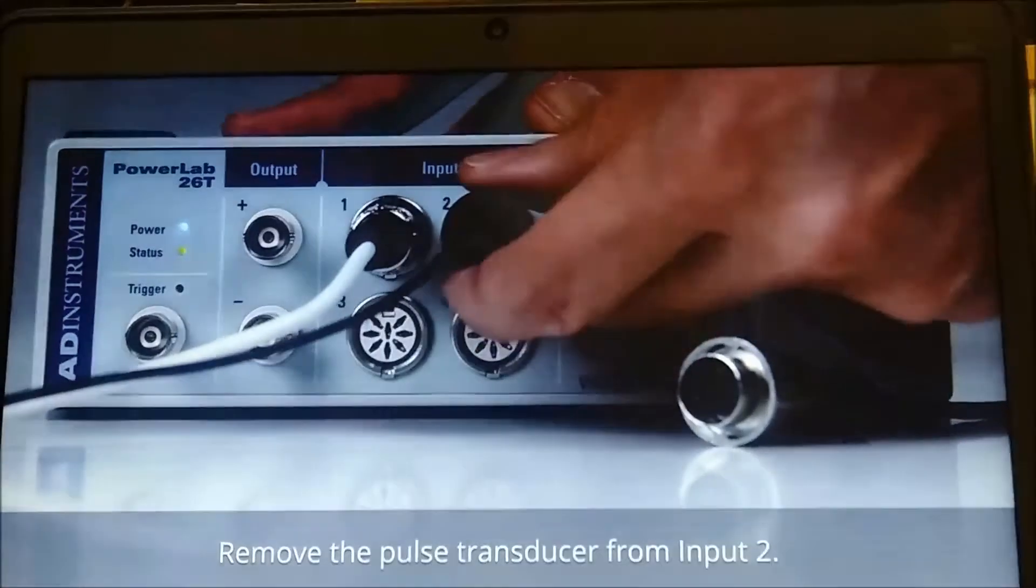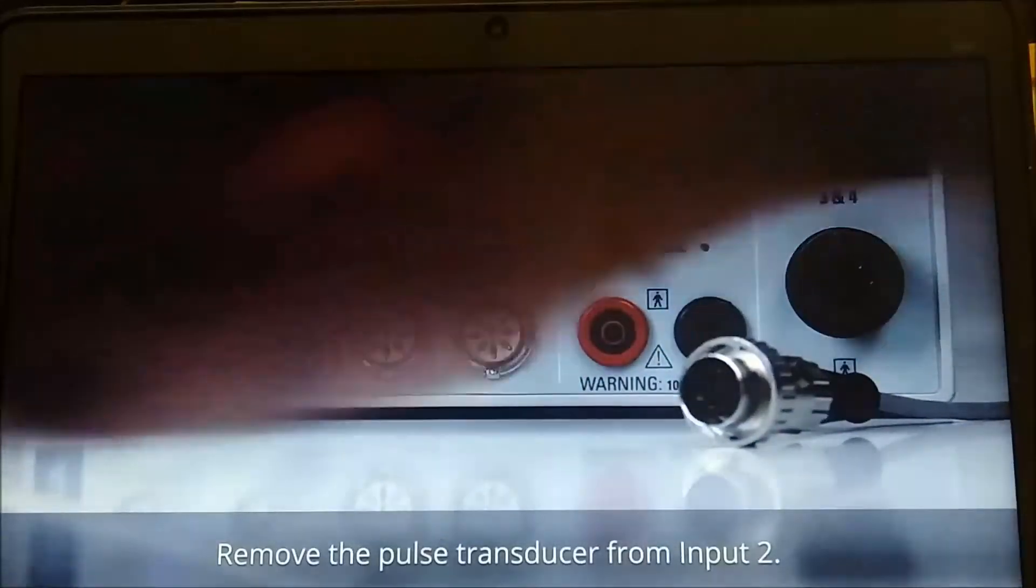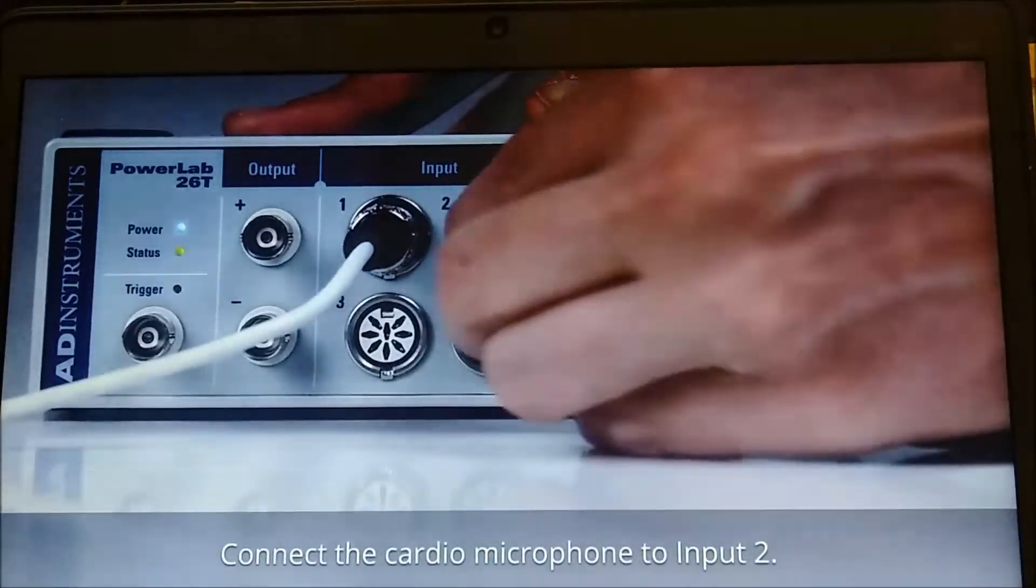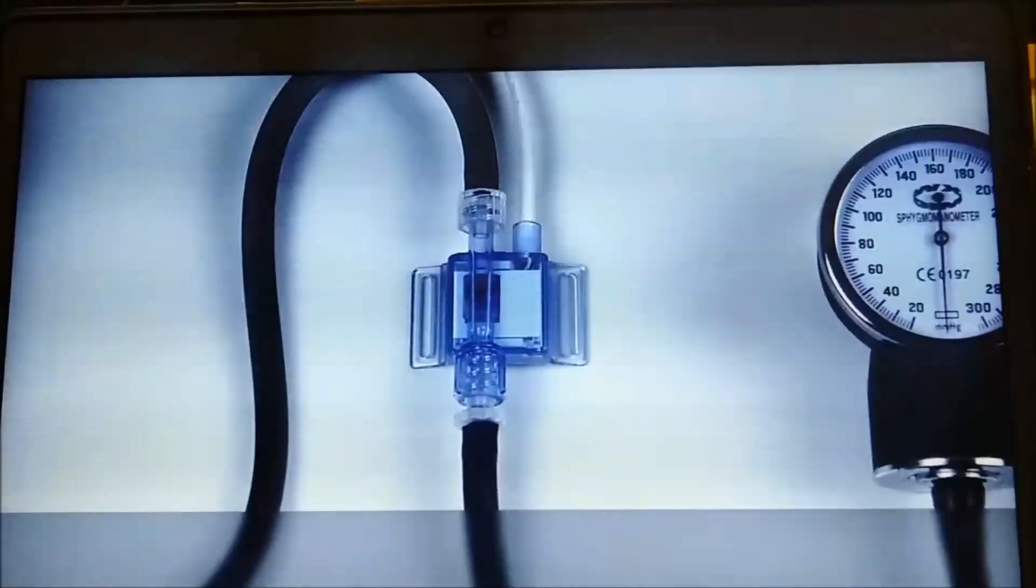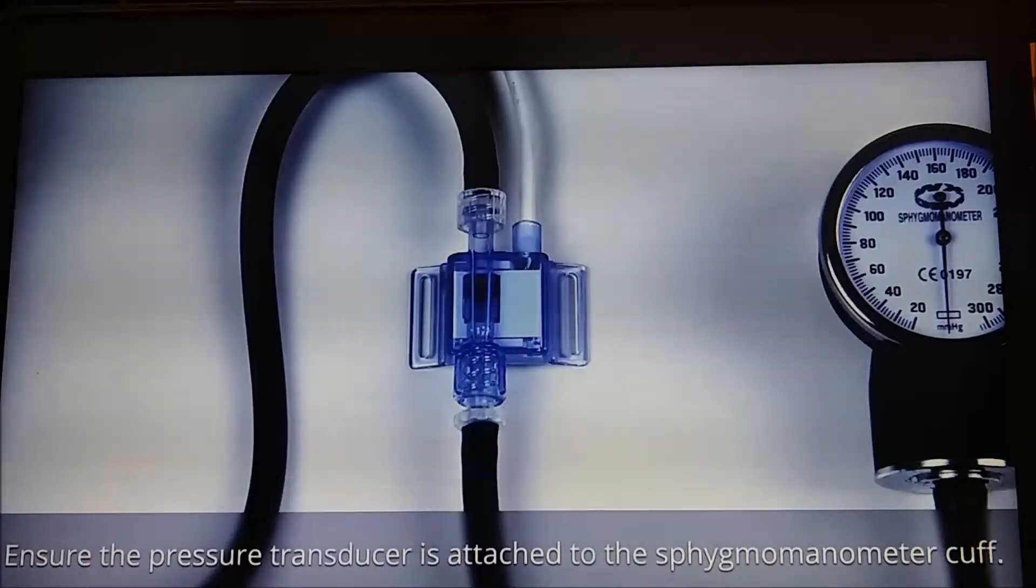Remove the pulse transducer from input 2. Connect the cardio microphone to input 2. Ensure the pressure transducer is attached to the sphygmomanometer cuff.